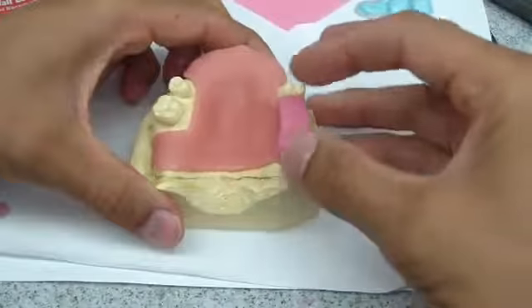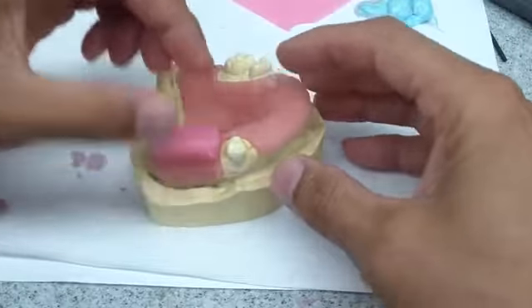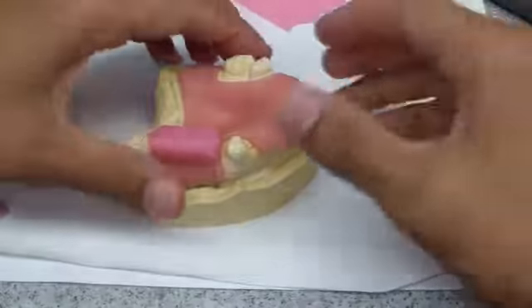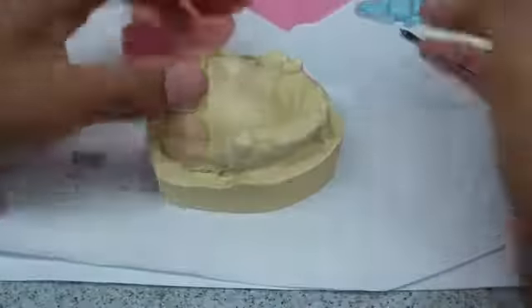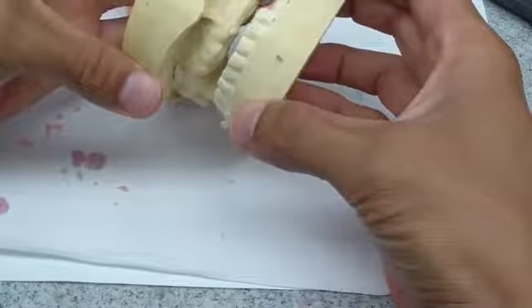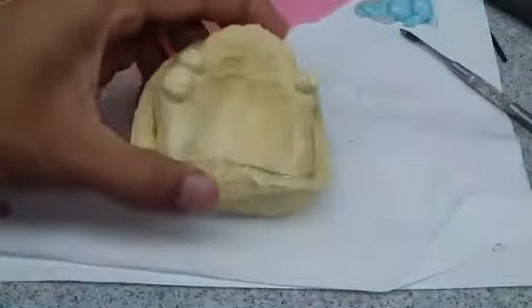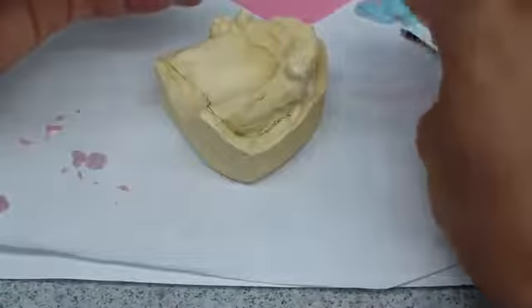So I've added a piece of wax rim to this denture base. Now, two things I forgot to mention earlier: you could conceivably use Blue Mousse or some sort of polyvinyl siloxane or any kind of registration material to capture your registration, by all means. That's one way. This is what we find to be a little more stable. However, that comes down to more of an opinion.